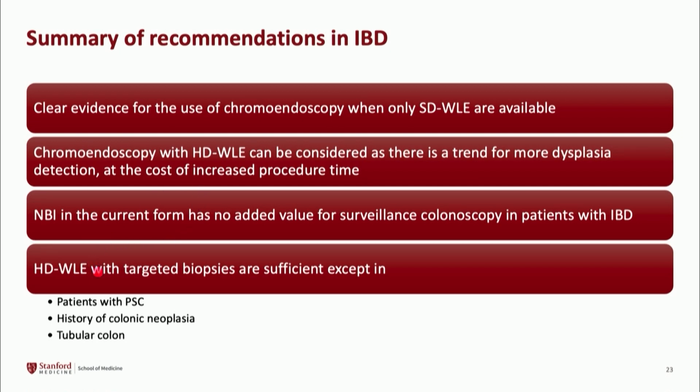And when you're using high definition white light endoscopy, targeted biopsies should be sufficient, rather than random biopsies, except in conditions like primary sclerosing cholangitis, patients who have a history of colonic neoplasia, or patients who have a scarred tubular colon.